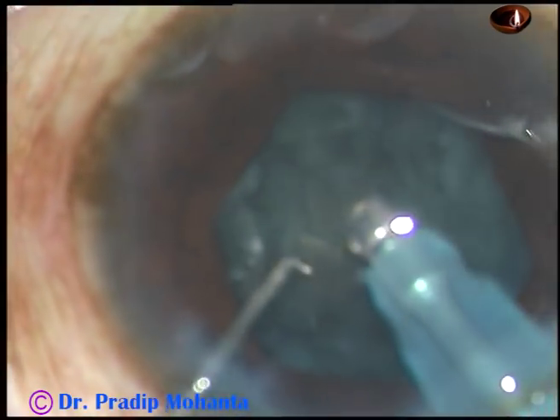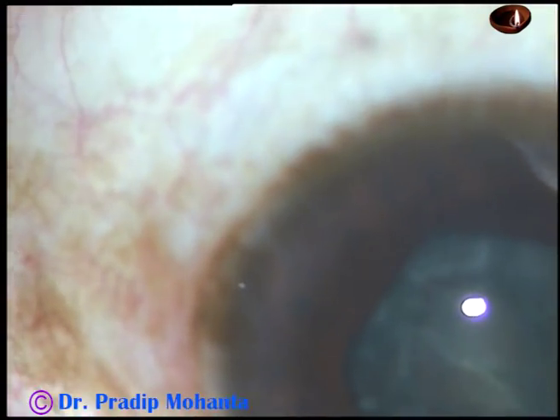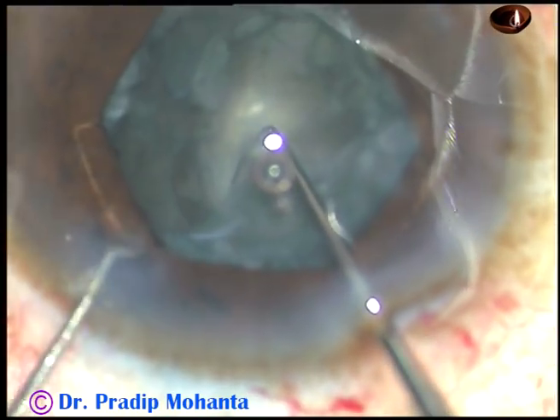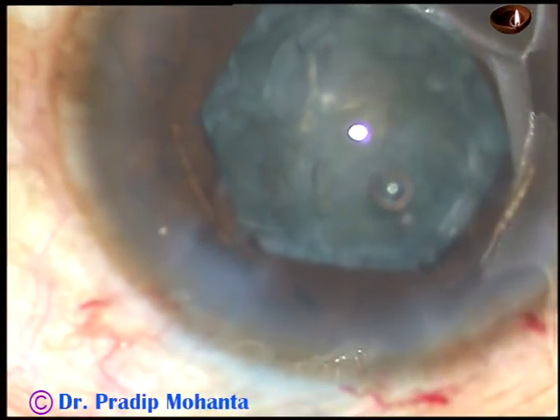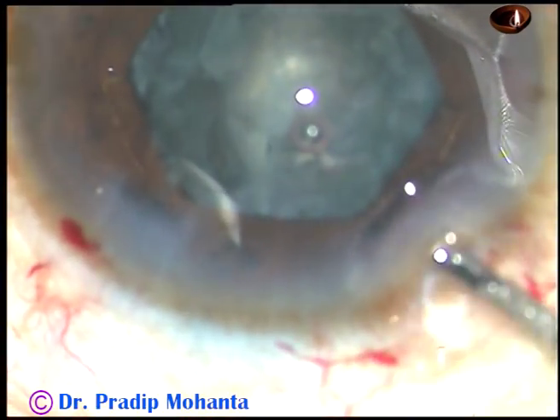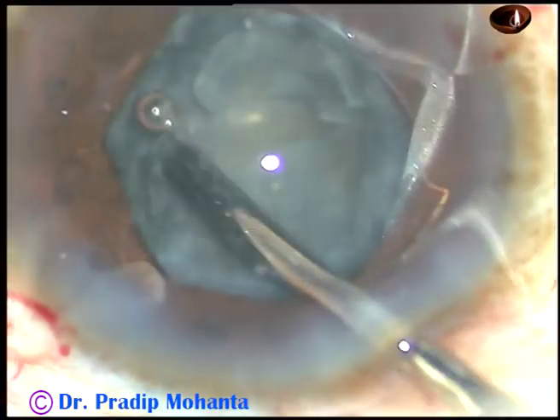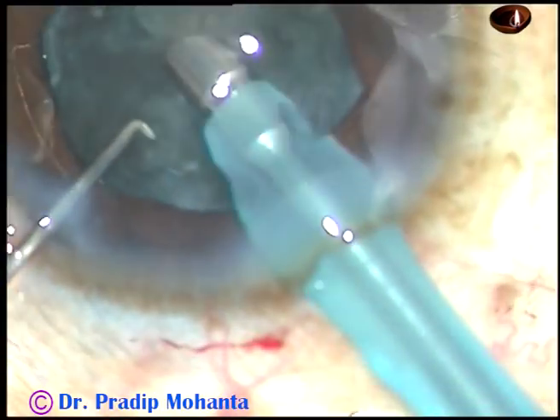Now the nucleus is rotating, but I am not able to lift up one heminucleus. I injected viscoelastic substance and I can see that the two heminuclei are totally separated. But I cannot lift one heminucleus over the other and emulsify it easily. Again I inject viscoelastic substance and use an iris spatula to try to lift it, but this instrument is quite thick and I could not use that.